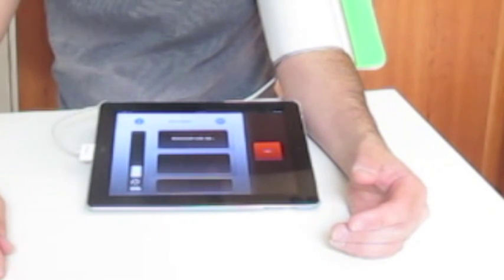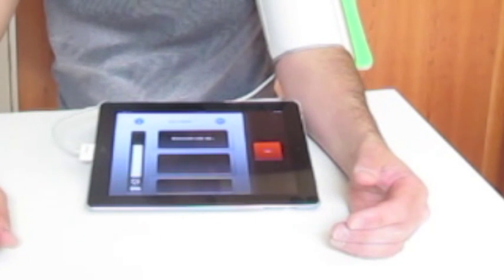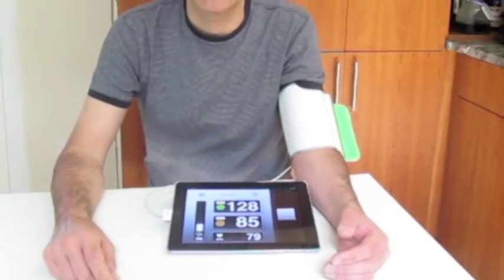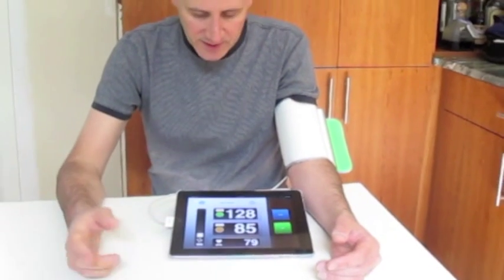And it's inflating. There are four small batteries in the large white cylinder. It's now measuring, coming down. 128 over 85, pulse 79 — which is actually pretty good. You can see the battery indicator here showing what's happening. Let's just hit it one more time.